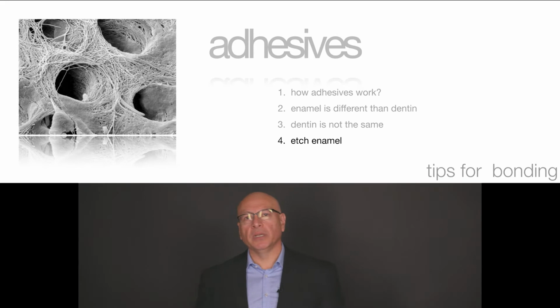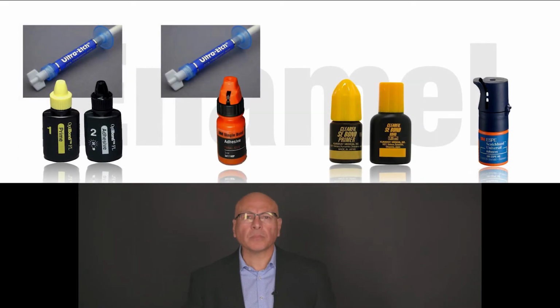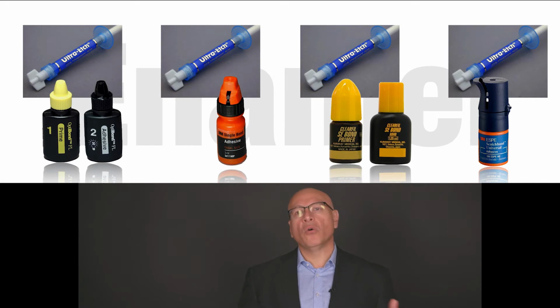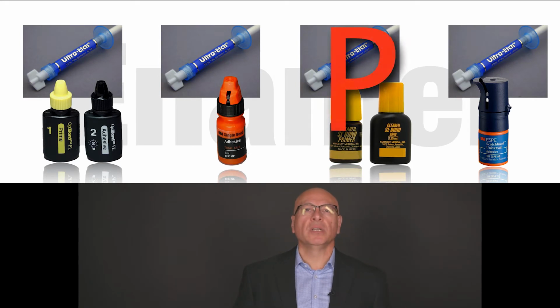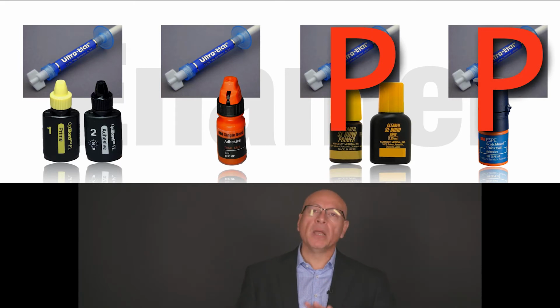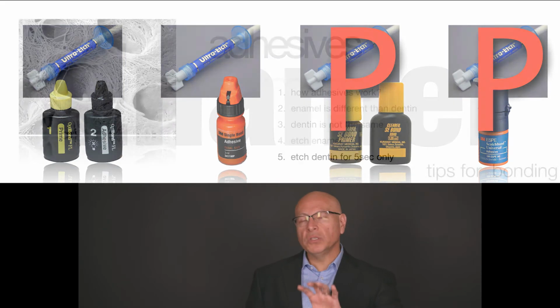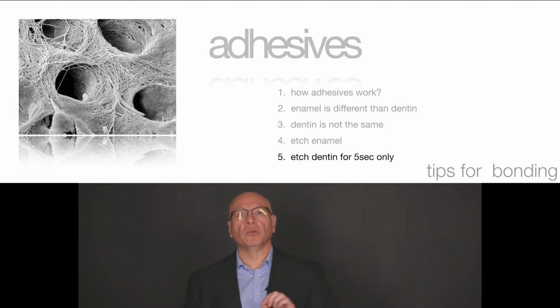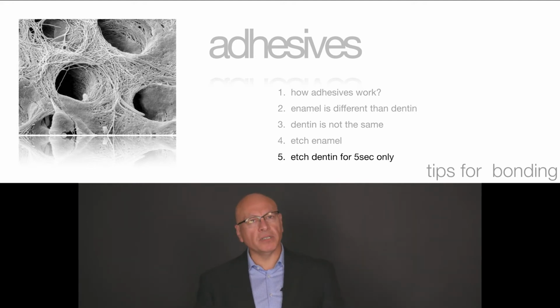My fourth tip is etch enamel. No matter what you use, whether you are a total etch or a self-etch person, you need to etch enamel completely, okay? Of course, you're not going to etch your dentin in the self-etch, but you want to etch your enamel. Always, always, that's the best adhesion you're going to get, no matter what it is. Always etch your enamel.